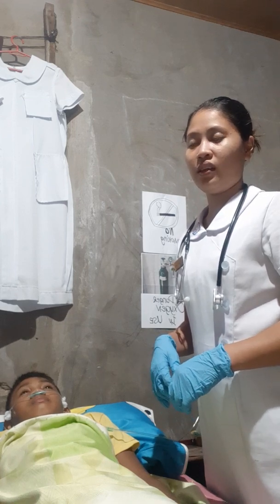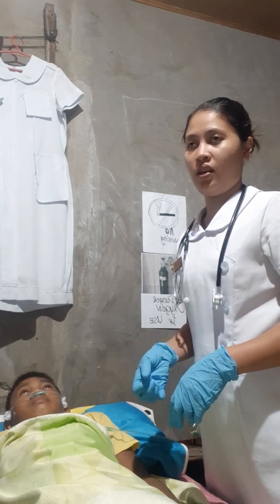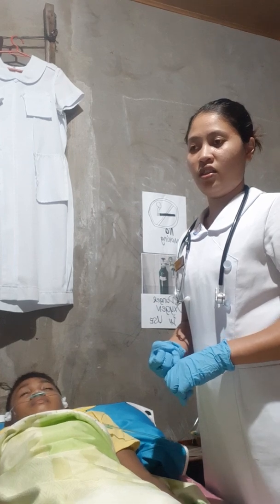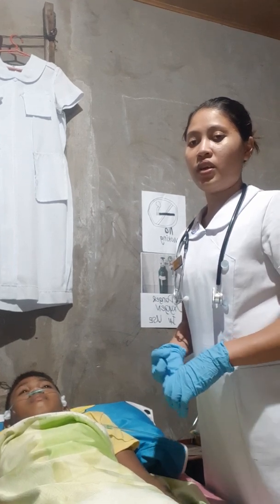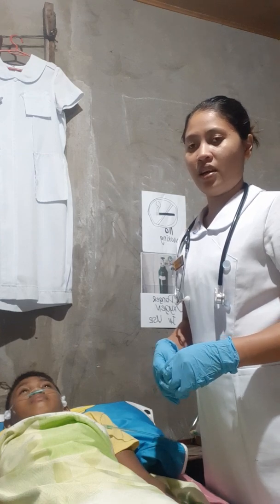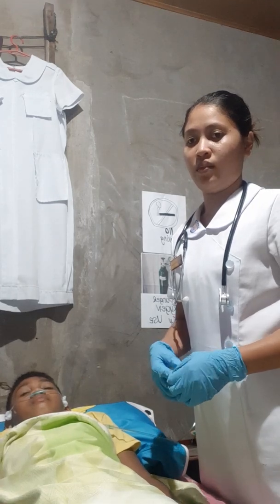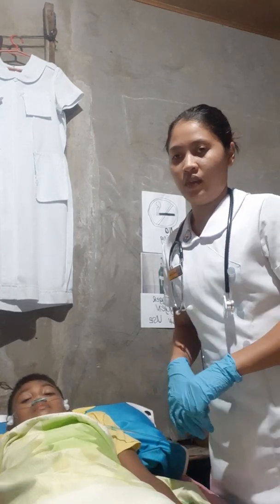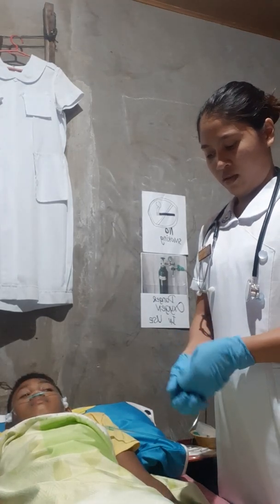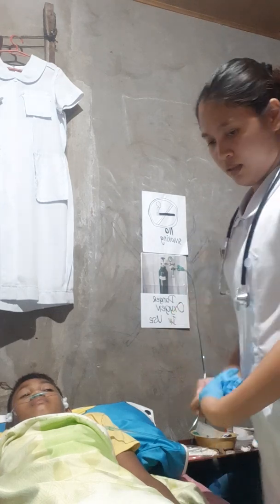Then in the nursing shift report, include the oxygen therapy, the respiratory assessment findings, oxygen delivery method, flow rate, the client's response, also the adverse reaction or any side effects from the client. Then next, remove gloves.